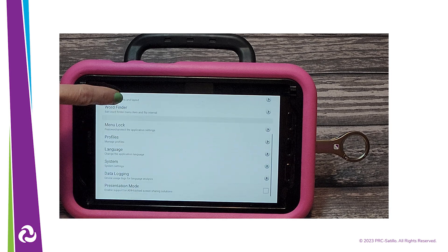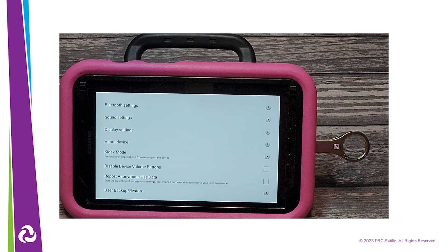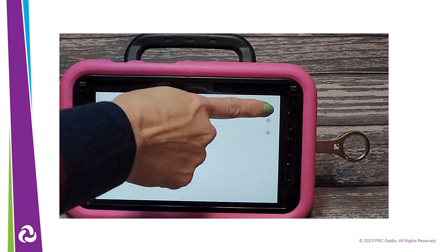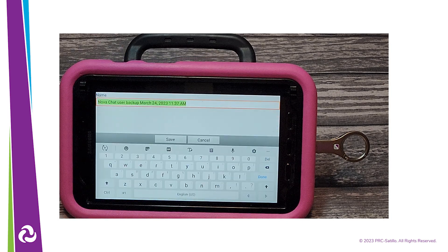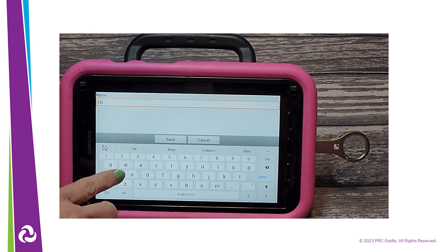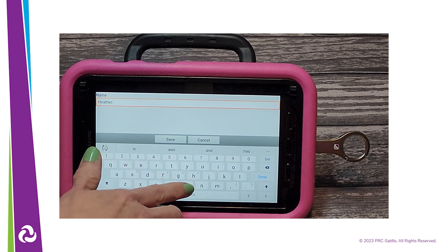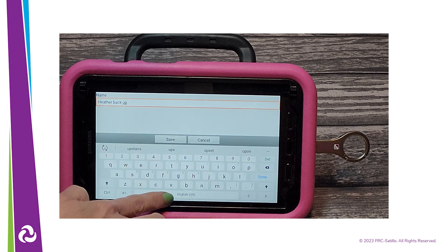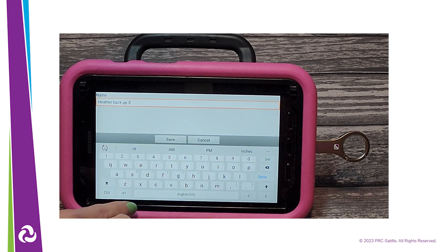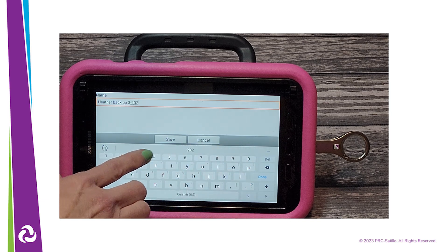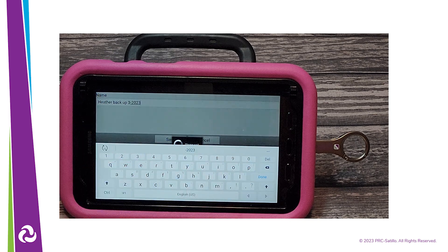Swipe up and select System. Select User Backup Restore. Tap on User Backup. Give the backup a name. You can add the date of the backup if you would like.